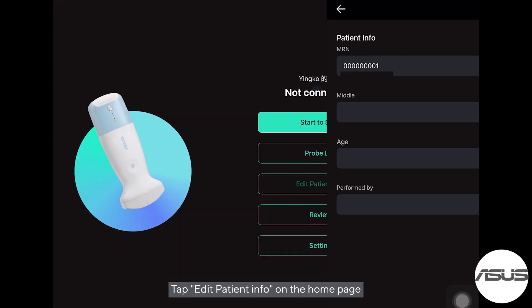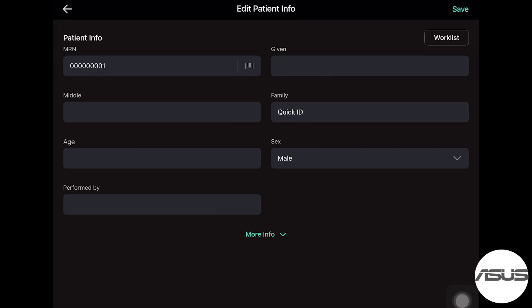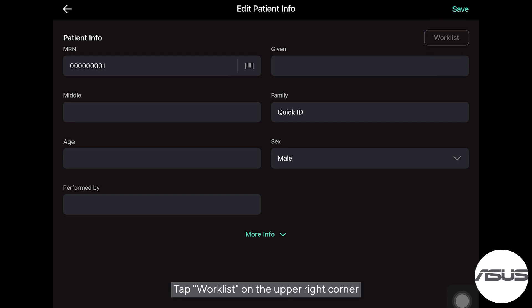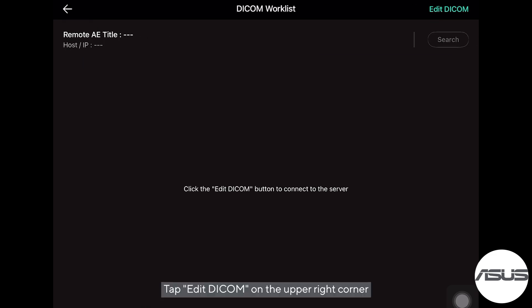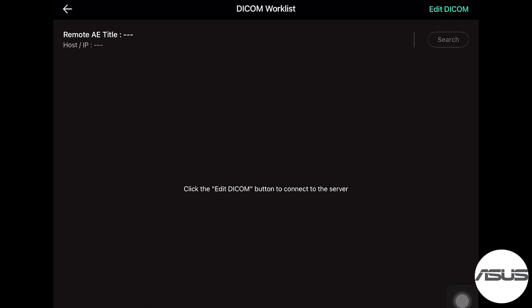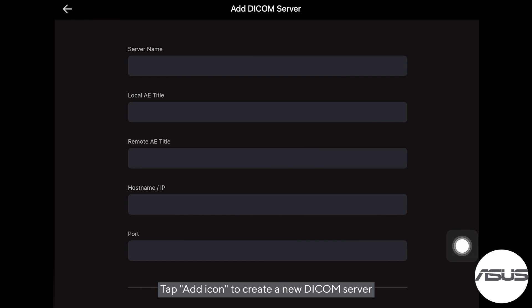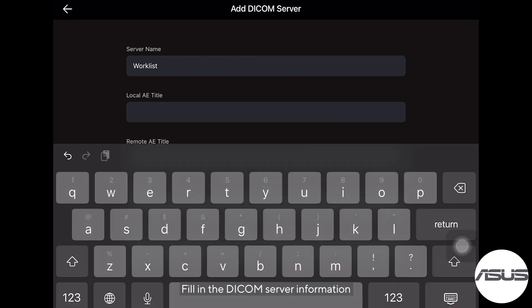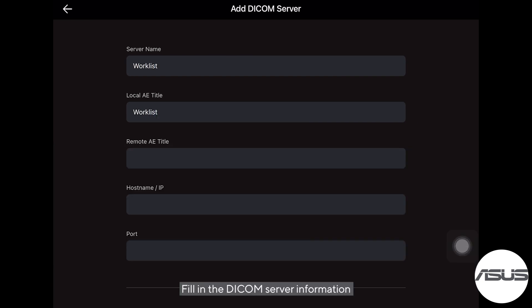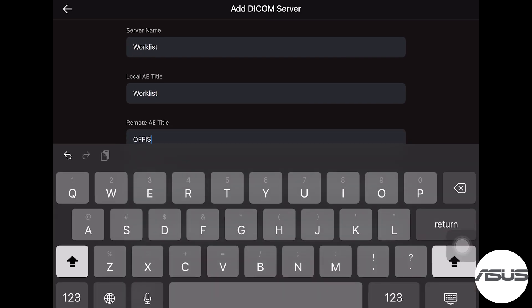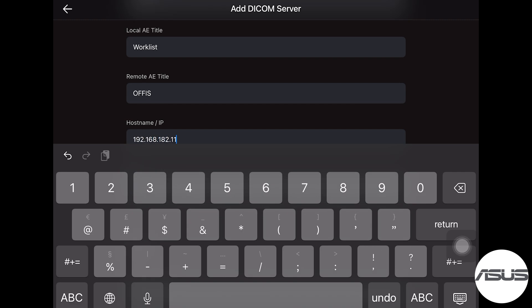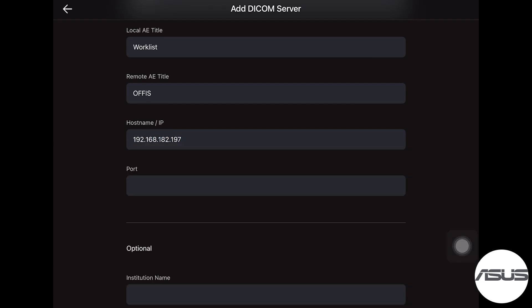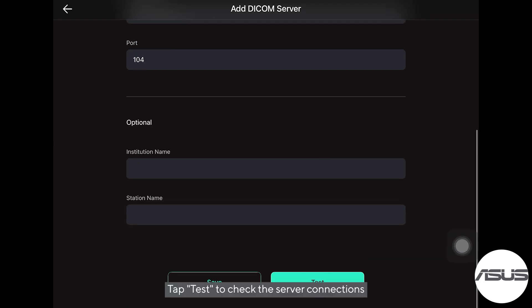Tap Edit Patient Info on the home page. Tap Worklist on the upper right corner, then tap Edit DICOM on the upper right corner. Tap the Edit icon to create a new DICOM server and fill in the DICOM server information. Tap Test to check the server connection.